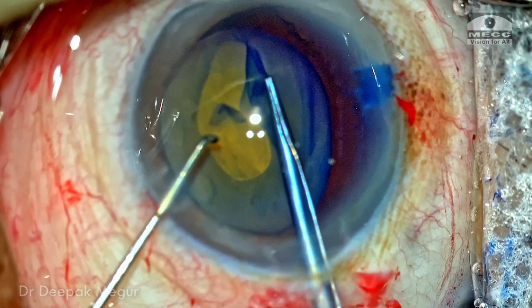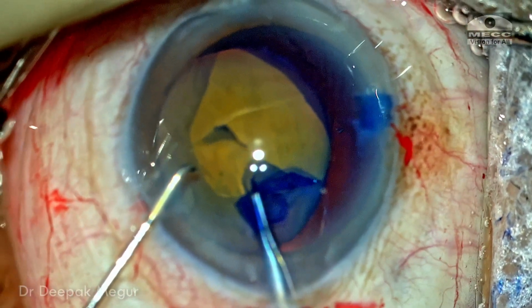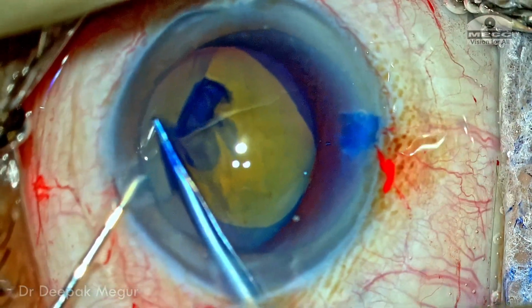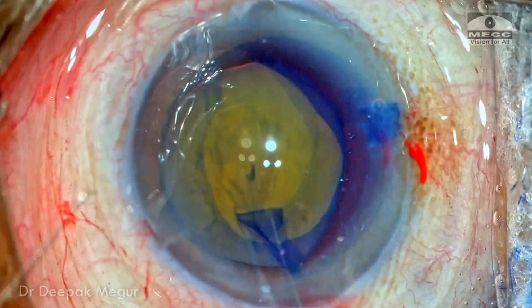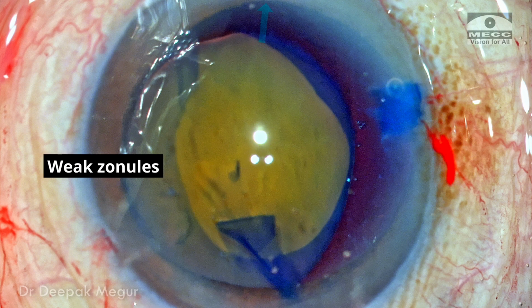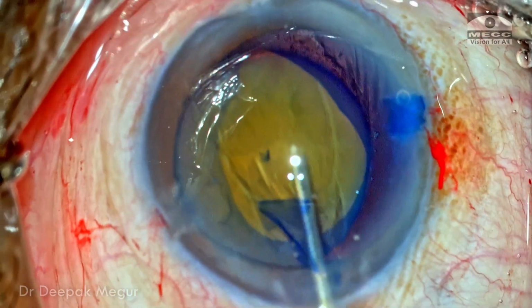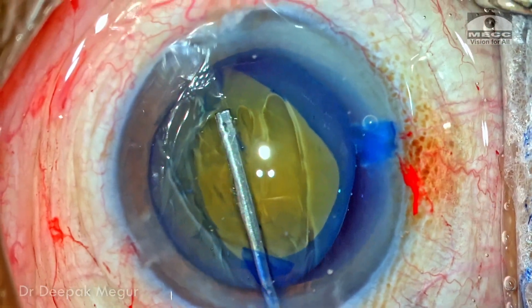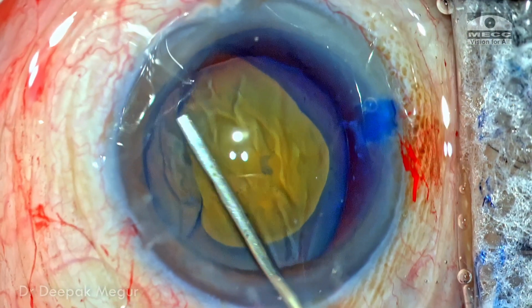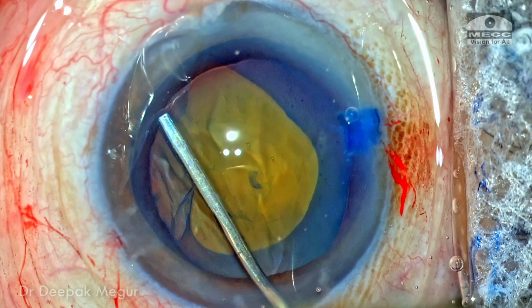With a combination of pulling and tearing, eventually in the area of the weak zonules, the capsular rhexis could be extended, and then the rest of the capsule looks to be reasonably healthy. So I have a rhexis which is pear-shaped, and this quadrant is the area where there is a zonular weakness. But the rest of the quadrants look alright. I'm trying to go in with my hydrodissection cannula, trying to pass it under the capsule of the nucleus. In some quadrants it does pass, but at this quadrant towards my left side, the capsule is firmly adherent to the nucleus. I am unable to pass it, and any forceful attempt is going to worsen the zonular dehiscence.